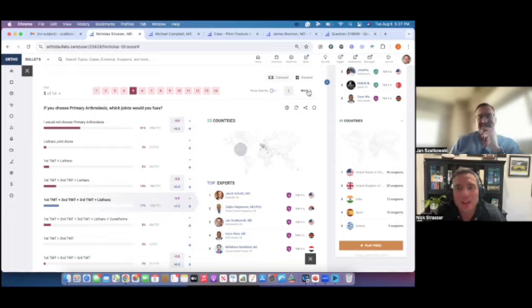Usually not, but again, I'm not using pins that often because I'm going to be just fixing it. Now, one thing that I have seen some of our trauma partners do is they'll actually do plantar based pins, and then they'll just run them up the canal, and that's kind of nice because then they're totally out of the approach. You do retrograde pinning of a metatarsal. I've had a couple cases like that, and this would have lended itself quite well to that. You just run it up the medial column in the intramedullary canal, and then you're totally out. Your skin incision for the pins is on the plantar side of the foot, and you're working from the top. So that's an option you can use as well.